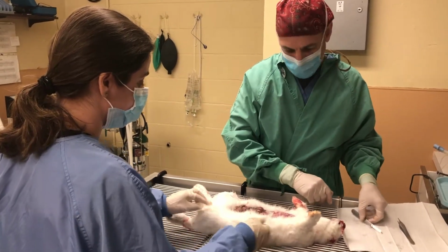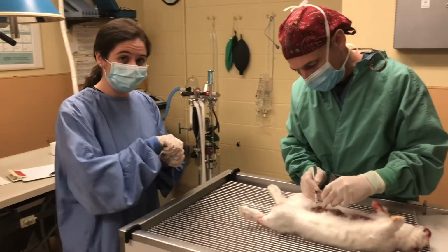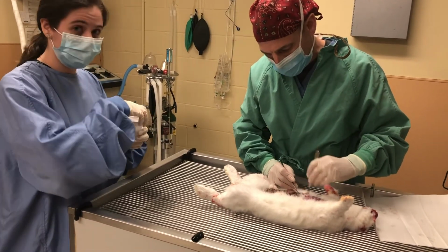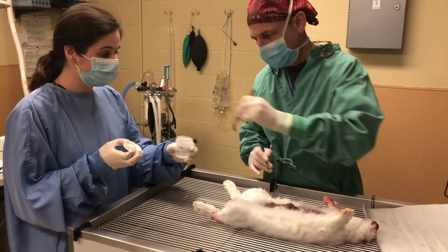We're going to get some biopsy samples. So I'm going to take my formalin jar. I'm going to uncap it. Looks like we're getting a bit of the intestines. Yes, our intestinal sampling. And I'm going to hold it out to him so that he can drop the sample in without it being contaminated.